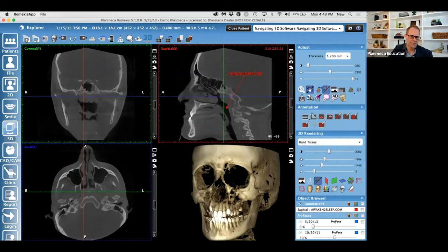So your 17 high is here. We're dropping down to about 15 here. So if I've got a 13 high image, I'm going to be down into 11 and cut off the nasion. That's why you'd have to have a 2D Ceph on your machine. If you want to take a cone beam and extract a Ceph, you'd have to have a 2D Ceph. So this image here is a nice image. Gives us all the information we need. So let's look at a couple things.